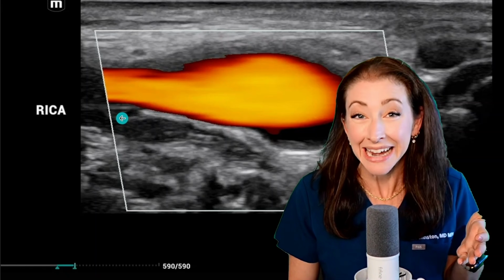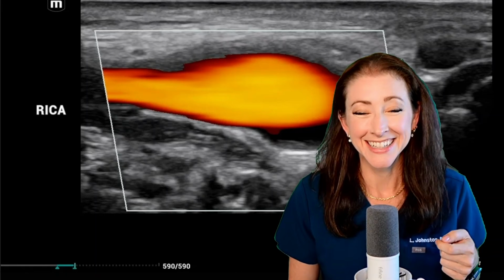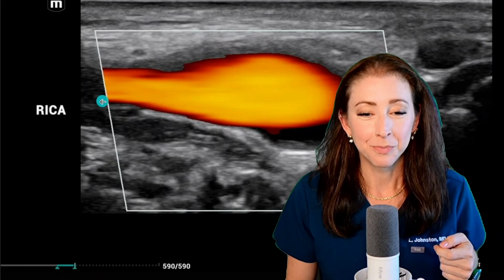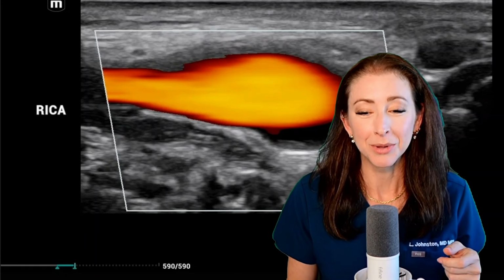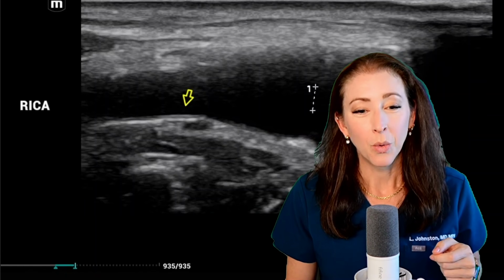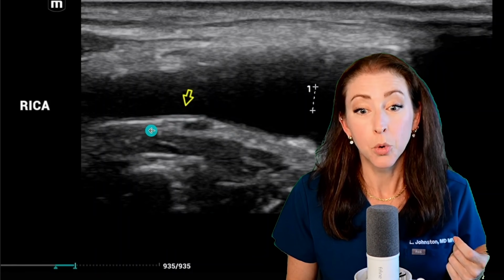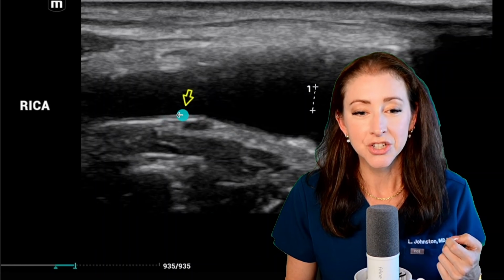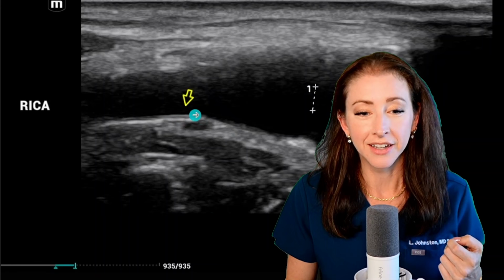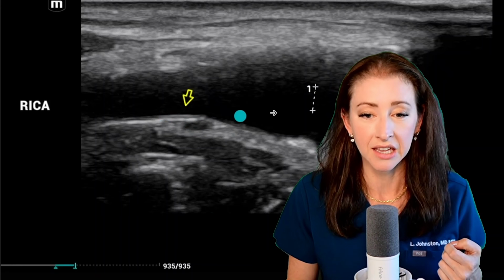There's nothing quantitative about this picture in particular, but everybody likes it because it has the pretty colors. So despite what some detractors would have you believe, there is actually adequate blood flow getting up to my brain. We will then look again for plaque. I picked the thickest portion I can see. I don't see any plaque here. You can see just this tiny little sliver of intima-media here, but that doesn't look especially thickened.